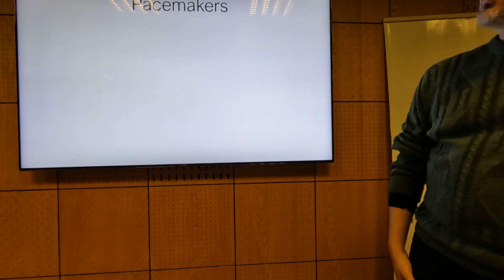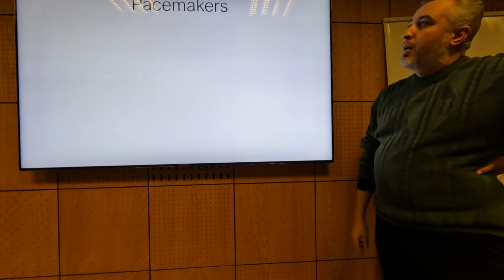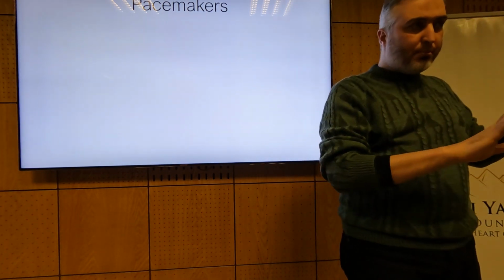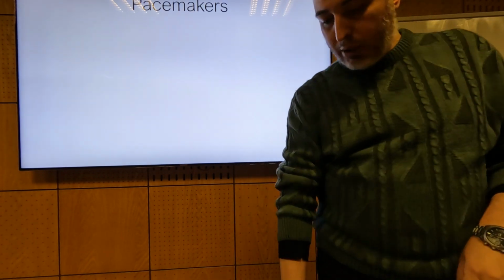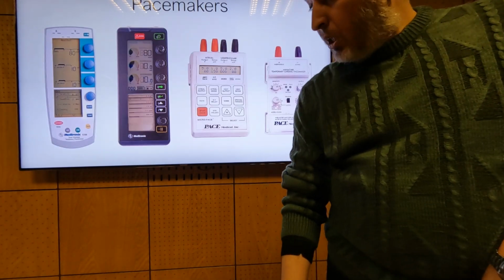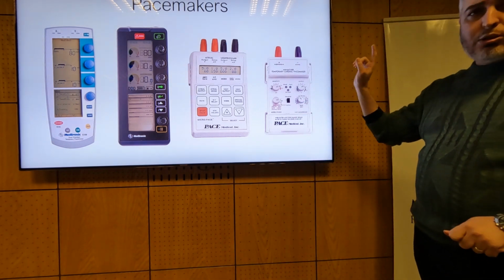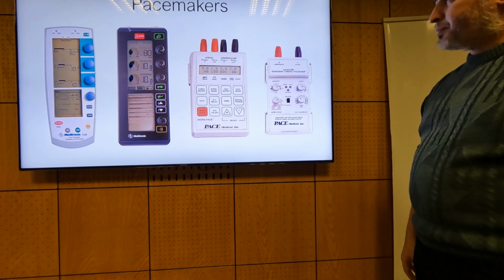Now we need to use these principles to essentially get adequate heart rate in as physiological a scenario as possible. So, trying to maintain AV synchrony, interventricular and intraventricular synchrony. There are different types of pacemaker and different boxes. Again, we're only talking about temporary pacing in this talk.